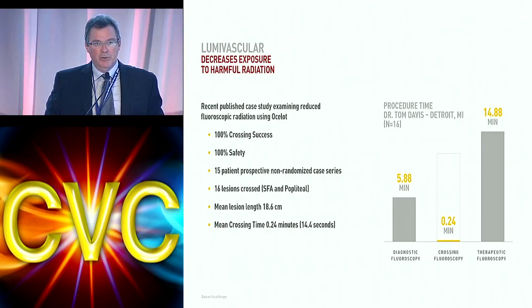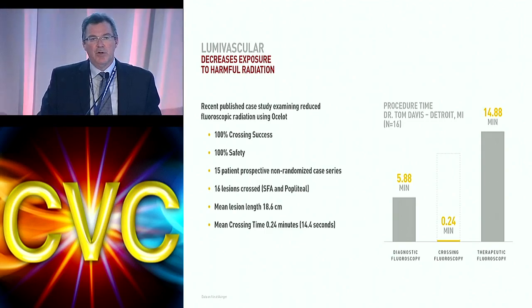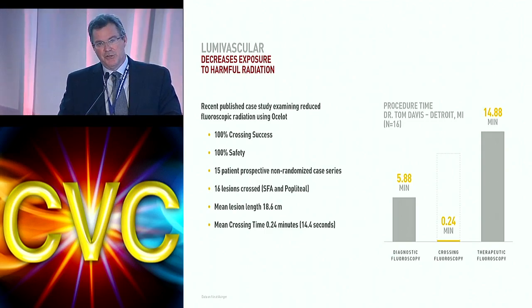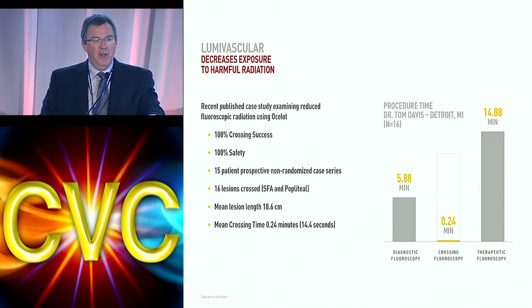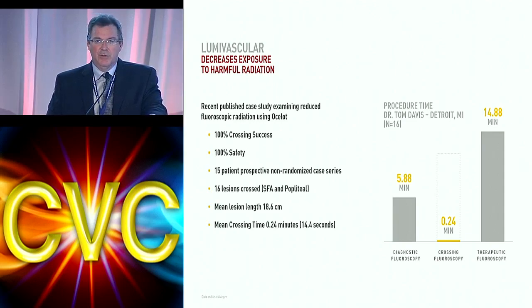If you look at the available data out there, the average crossing fluoroscopy time for crossing lesions is about 22 minutes. And think about it, you're going to have those that you cross very quickly. And I challenge any one of you who use loop wire technology to look at the fluoroscopy time that you're using, to see exactly how much fluoro you're actually obtaining there.